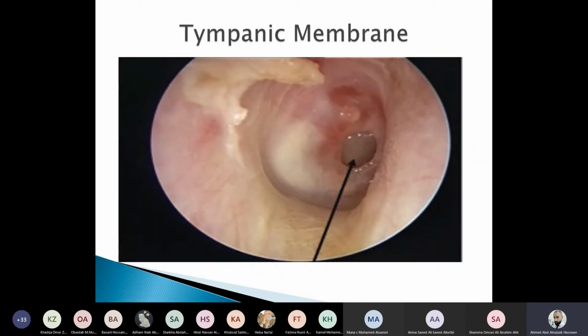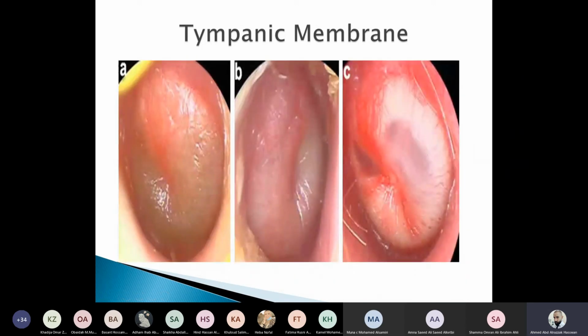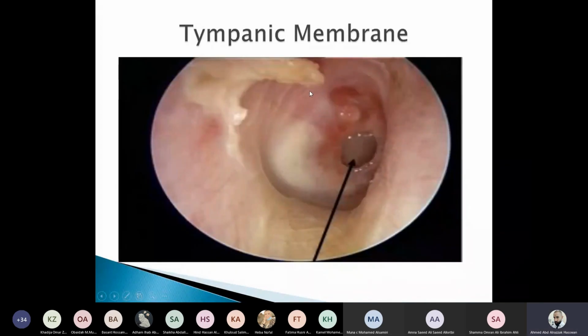Okay. Now let's take a look at this one. So what can we say about these tympanic membranes? What is this thing up here? Okay, you mean this one. So maybe this is pus. So this is of course abnormal again. Abdurrahman is saying wax.